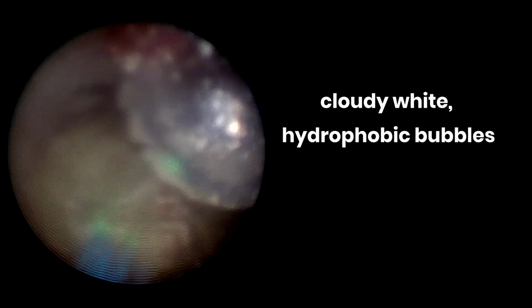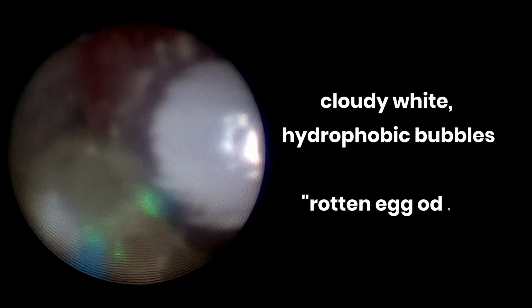An 8.5 French mini nephroscope was used and nephroscopy revealed stones, prompting the use of a holmium laser for laser lithotripsy. During the fragmentation of stones with the holmium laser, visible bubbles occurred. These bubbles appeared as cloudy white hydrophobic formations in the saline and emitted a distinct rotten egg odor.